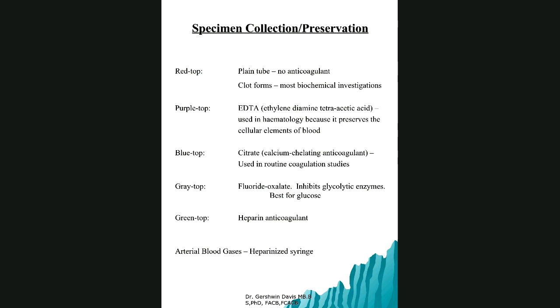Two points. One, you need to be familiar with the colors of the tubes that you use in your hospital, whichever hospital, wherever part of the world you're working in. You need to know what is the color of those tubes and what they analyze. Also, you need to look at one other thing I didn't mention here: what tube they use for trace metal analysis. Don't forget that.